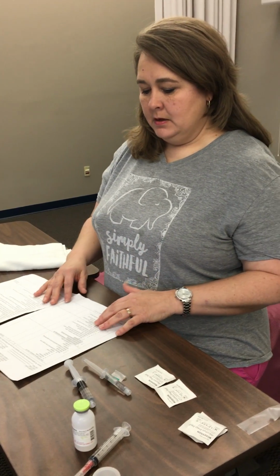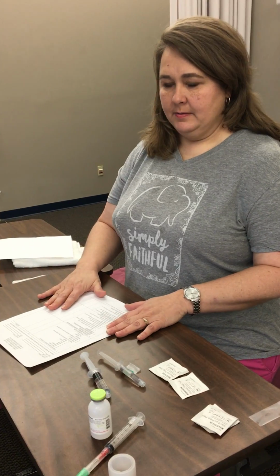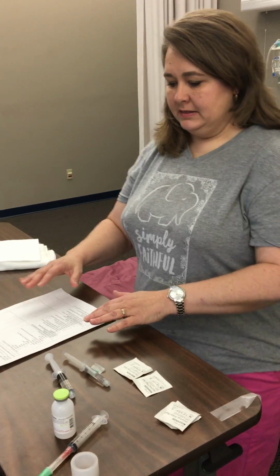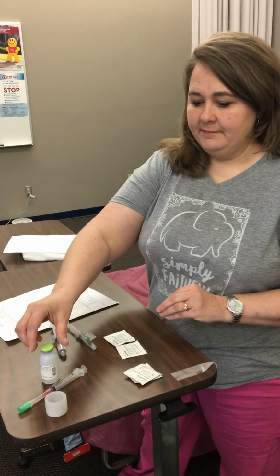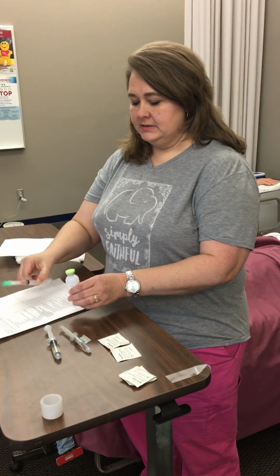Wash your hands, and when I go to the client's room, when I'm at the bedside, I want to identify at that time. At this step, I've completed with my physician's order, so I'm going to put that aside. So I just have my MAR here. I would, at this point, perform any contingencies prior to giving the medication and assess for the correct rate of administration when I obtain my dose. So I have my correct medication, and I have a syringe with a blunt needle.